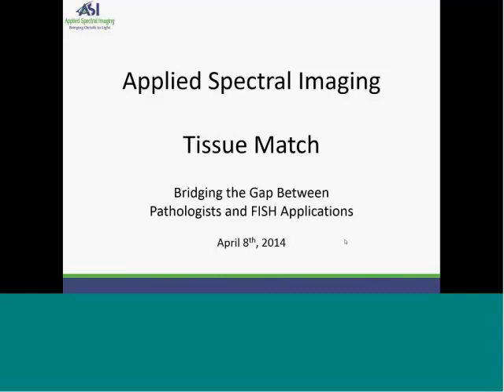Today's webinar will review ASI's tissue match application, a soon-to-be-released feature that will make tissue FISH more cost-effective while providing pathologists and FISH technologists with greater clinical confidence.